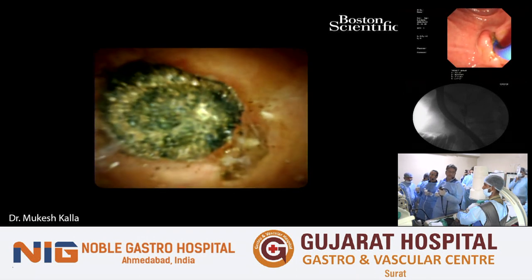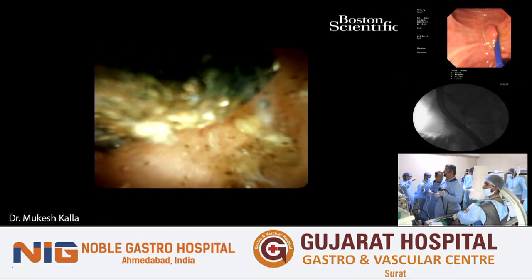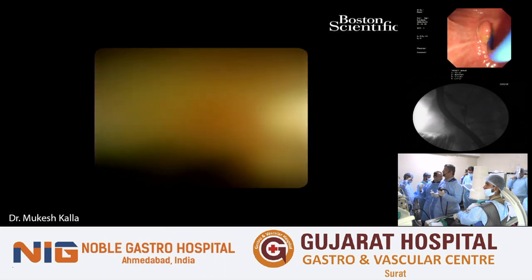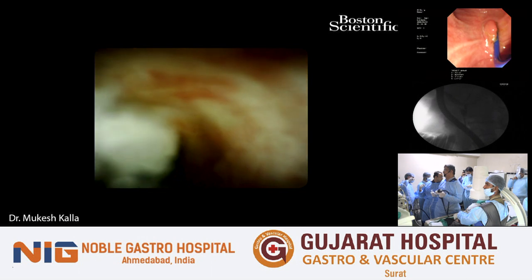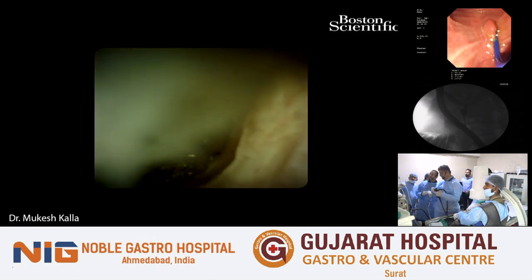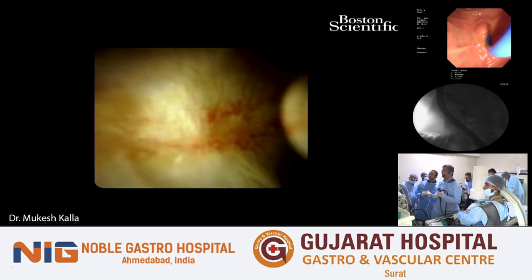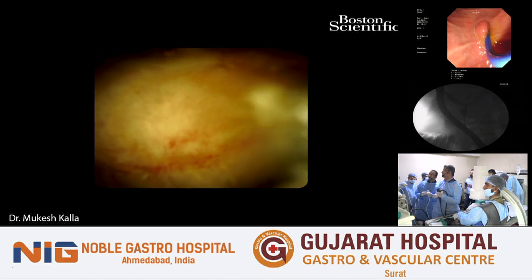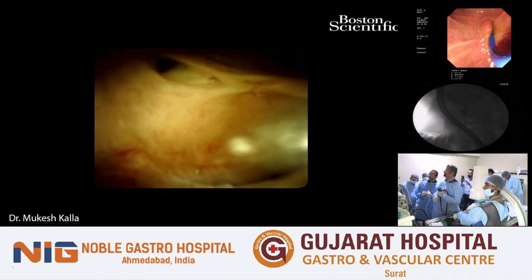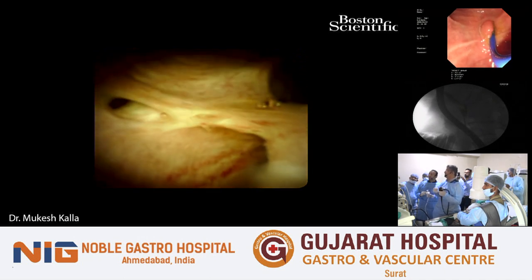We just insert a basket, sir? Okay. Give me a spy basket. So we'll keep it in the center. I deliberately went in. I thought that till we get the scope, let's do a proper inspection and come back.